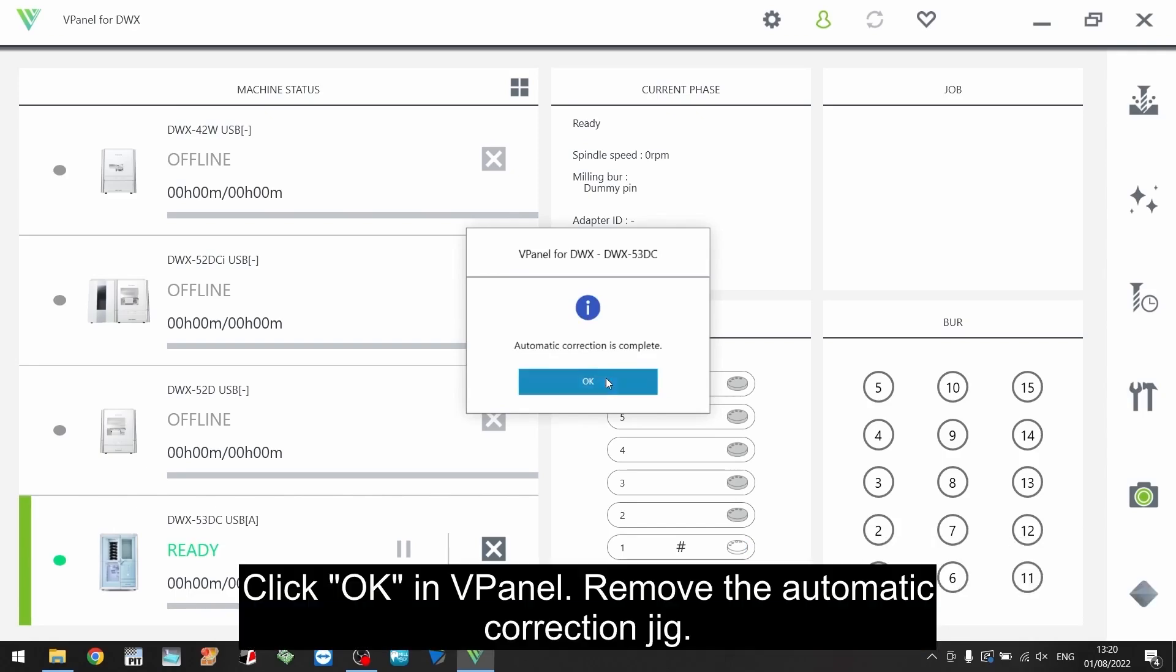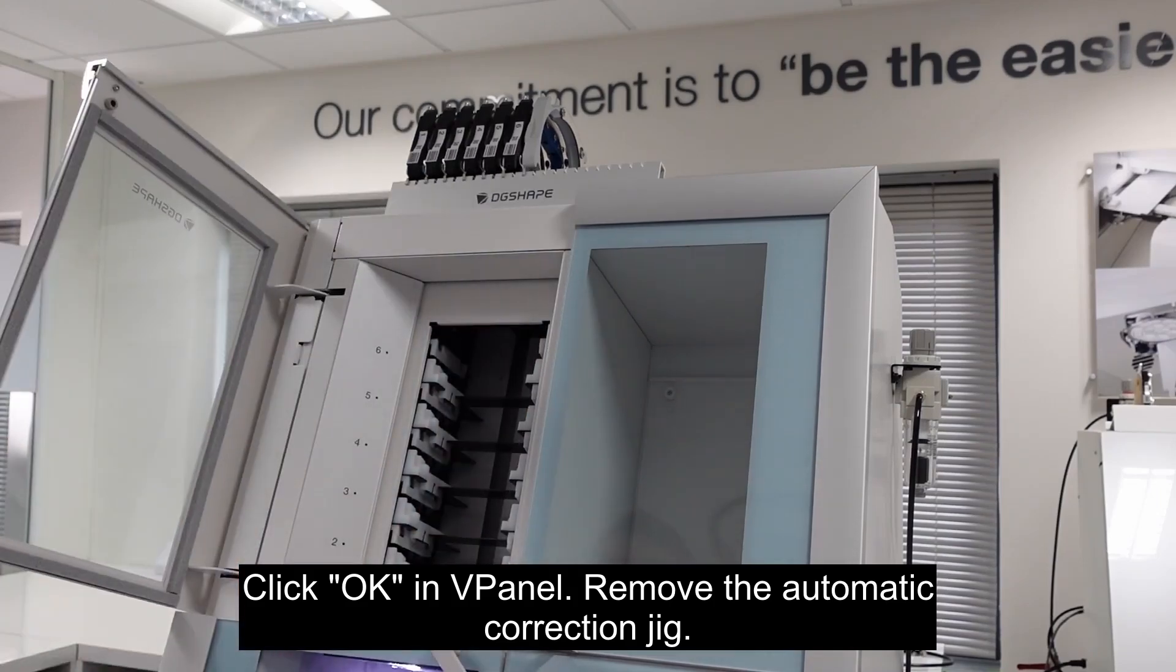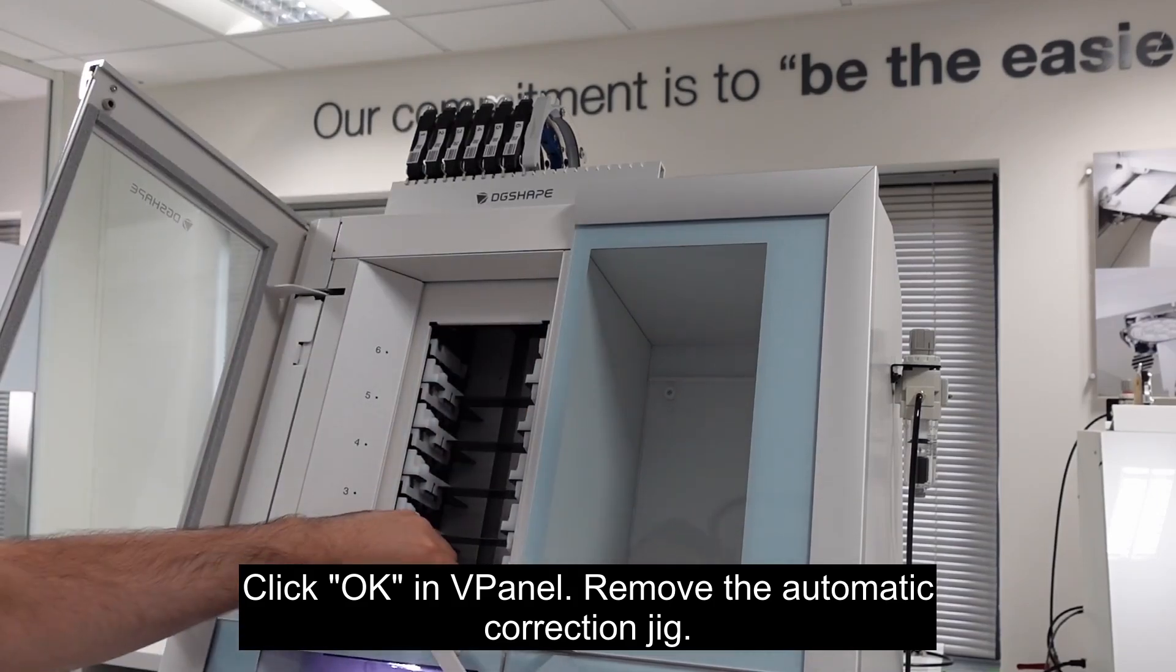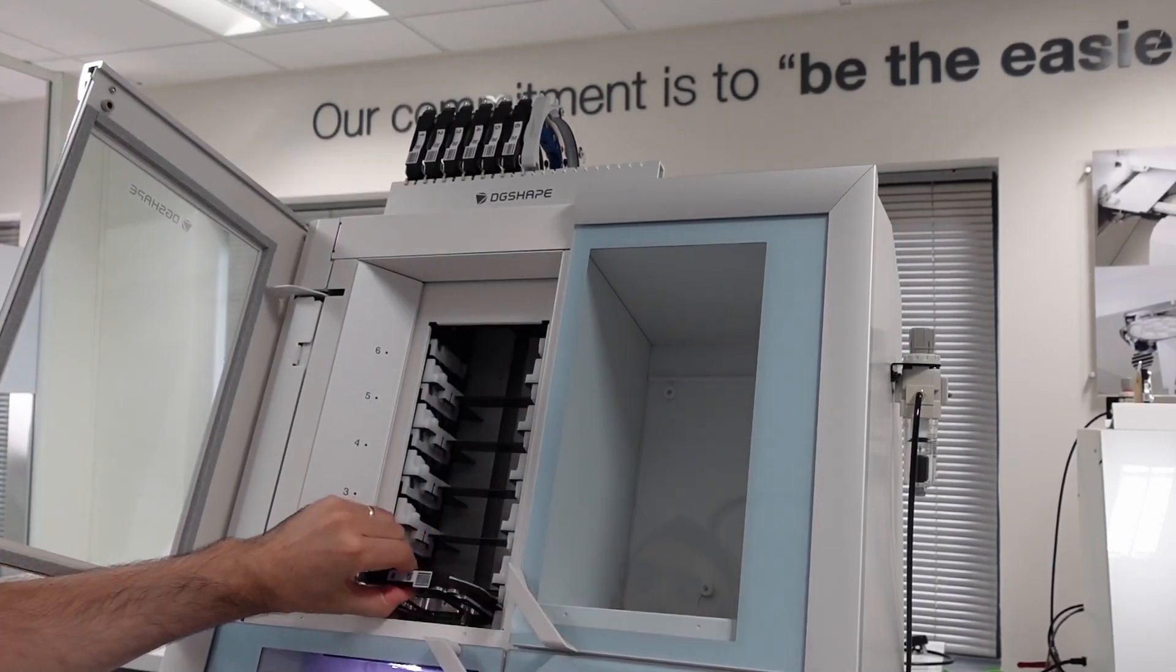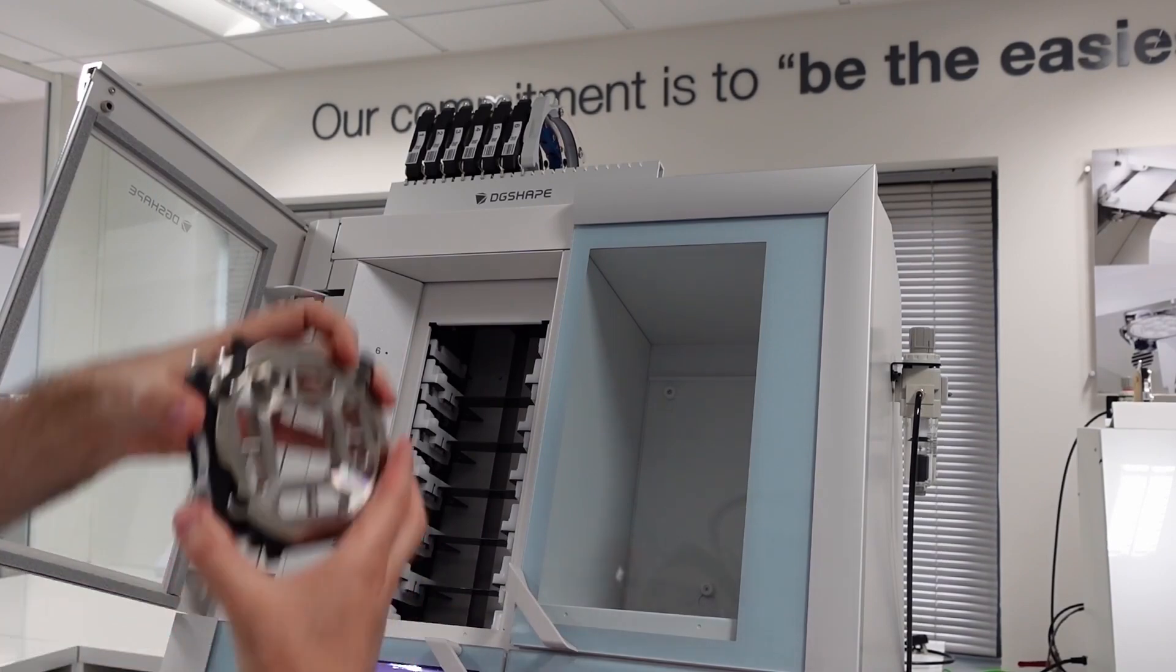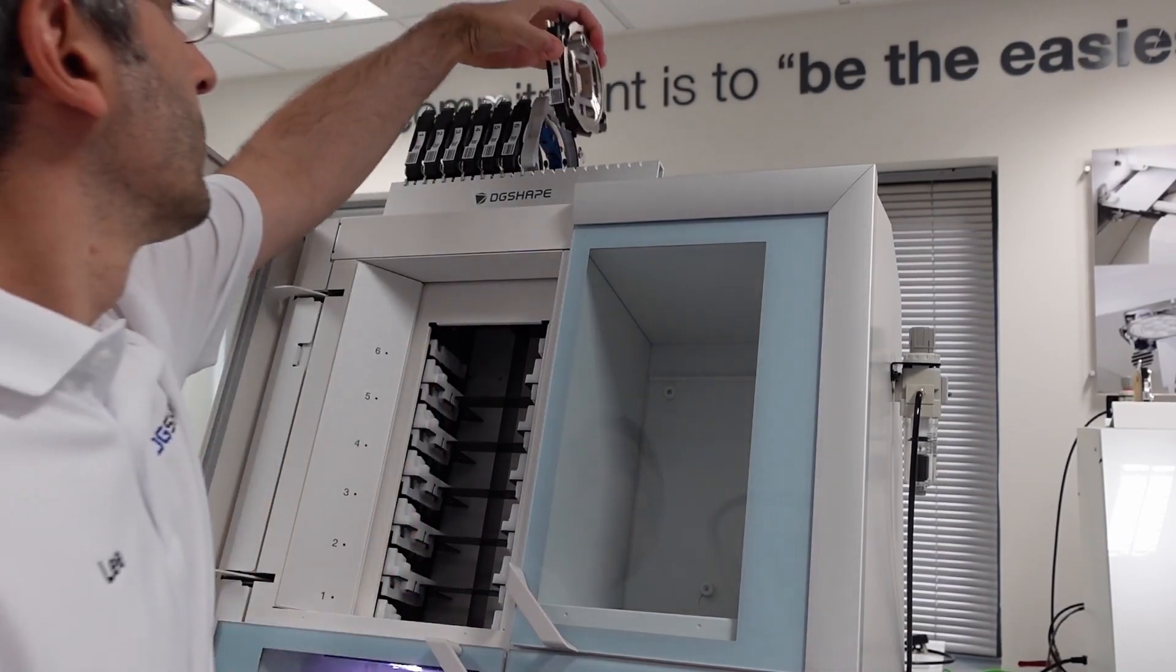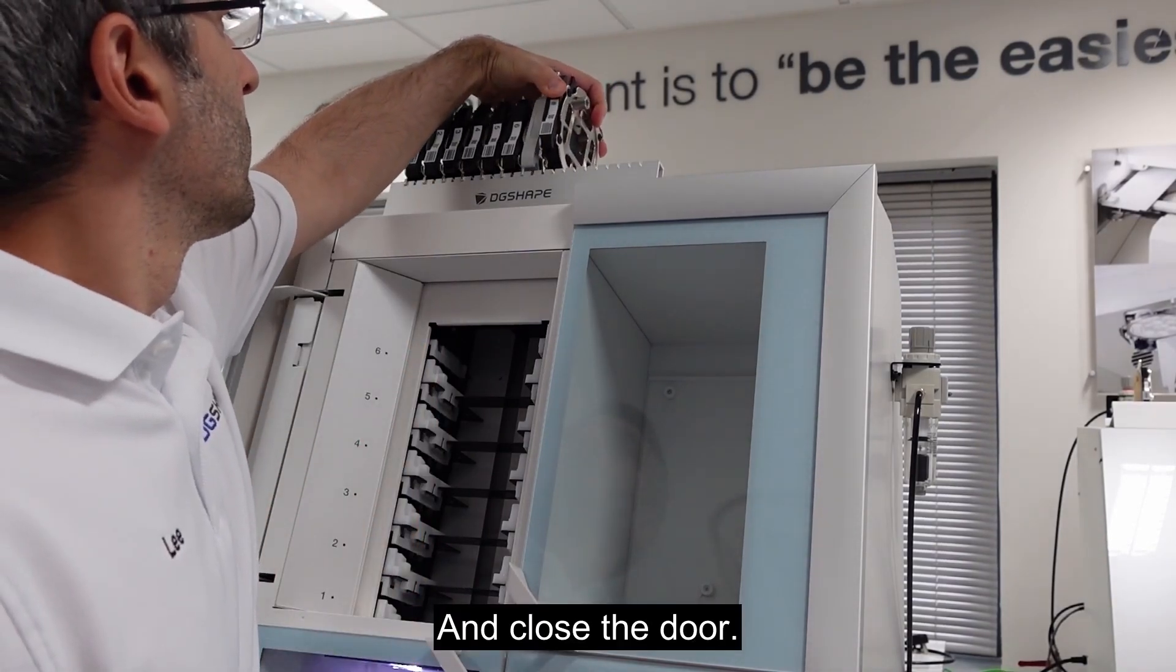Click ok in v-panel. Remove the automatic correction jig and close the door.